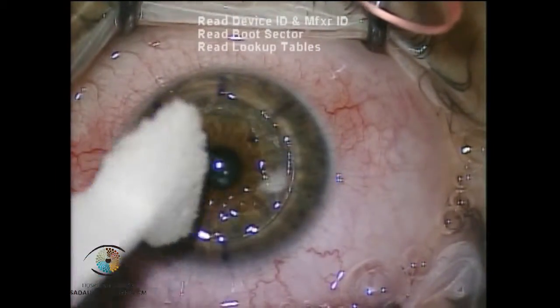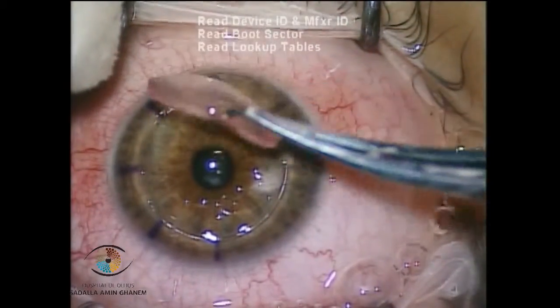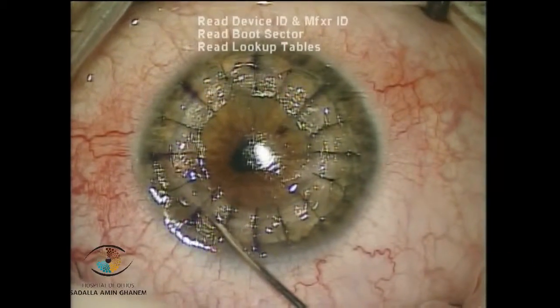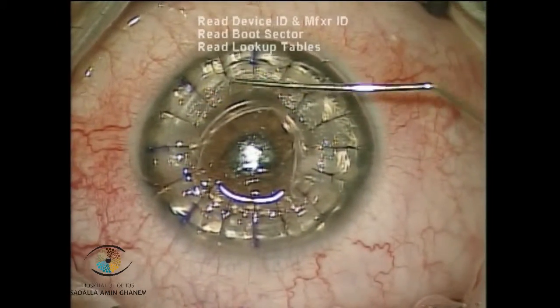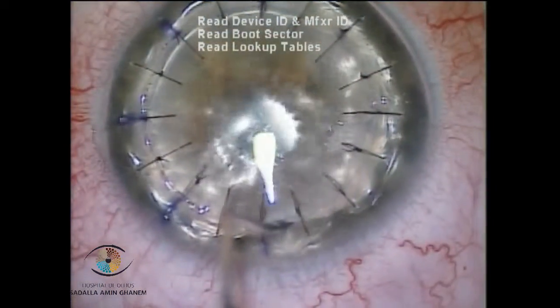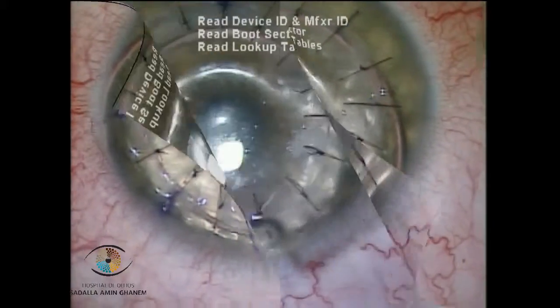Finally, the graft is put in place and sutured. At the end of the surgery, air fills the anterior chamber, some liquid and air is expressed from the interface, and finally a 50% air fill is left in the eye.